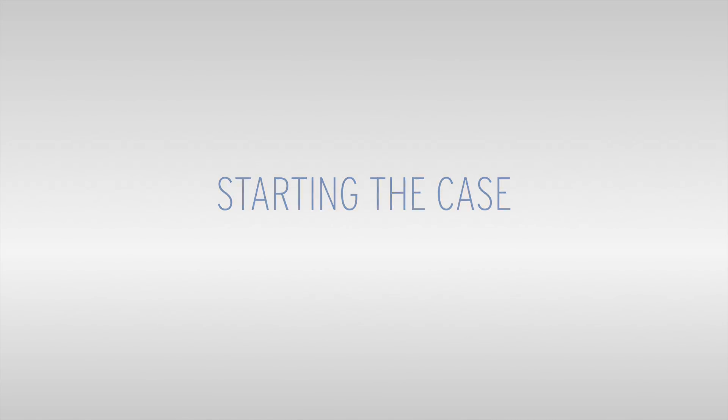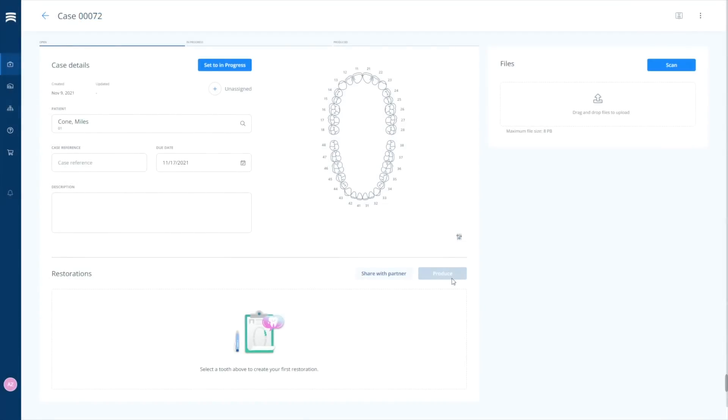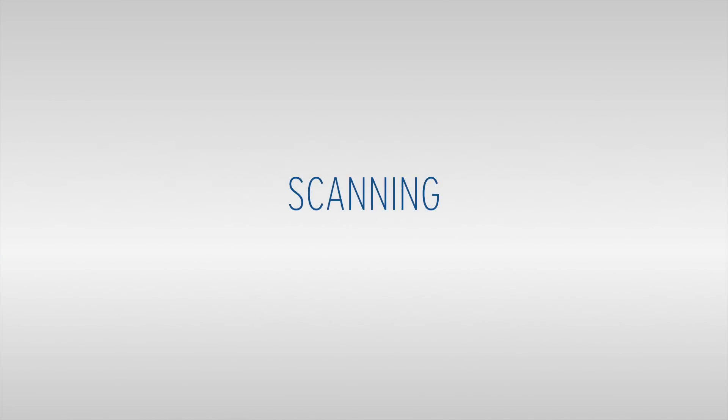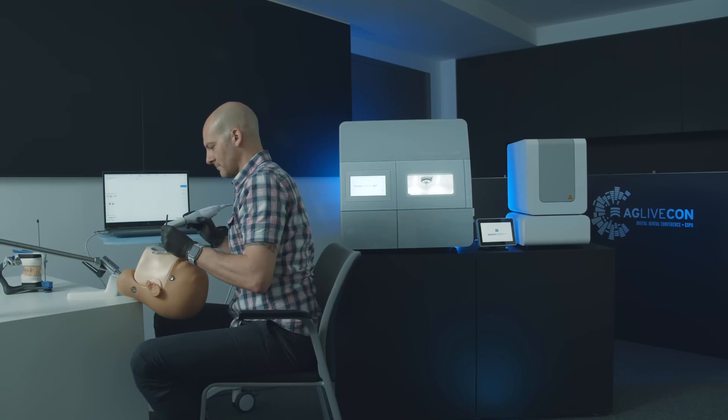The coolest thing here is that we can start the scanning process by selecting the patient only. Creating the case is not absolutely necessary, so as a dentist I can start directly with the scanning with just a few clicks to define what should be scanned, and now I'm ready to go.